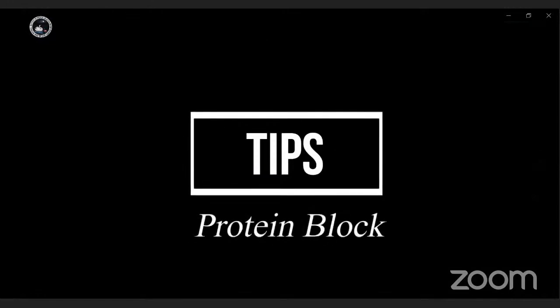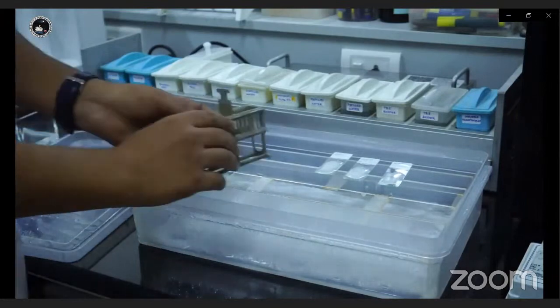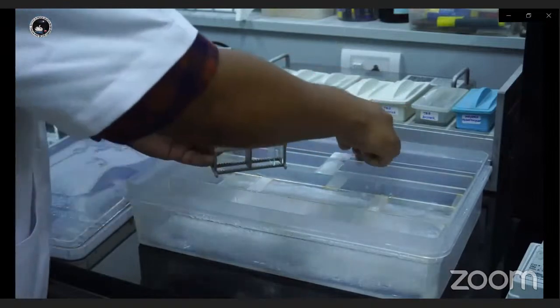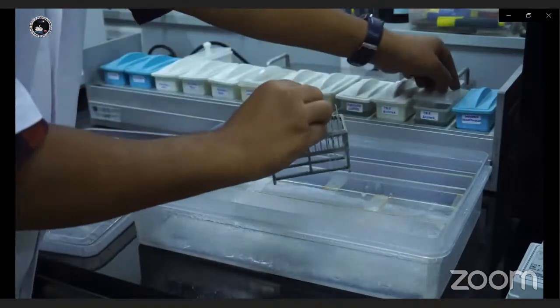This step of protein block is very important to prevent non-specific background staining. Several products are available like goat serum and commercial blockers. A simple technique is to use 3% milk powder, but make sure it is freshly prepared. It has to be completely dissolved, which may take up to 30 minutes. It is also good to filter it before use. Wash the slides in TBS for 2 minutes, 2 changes each.